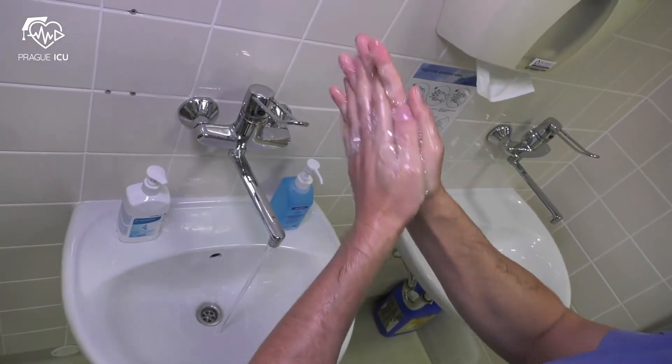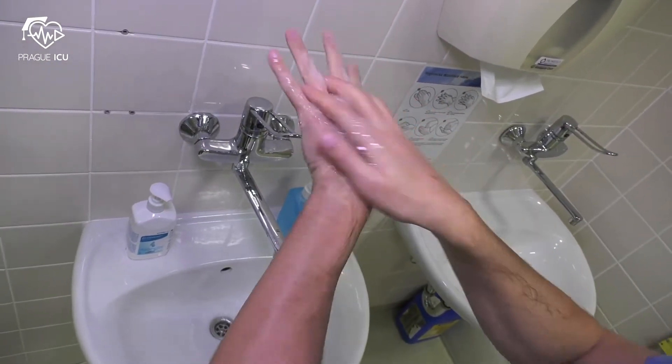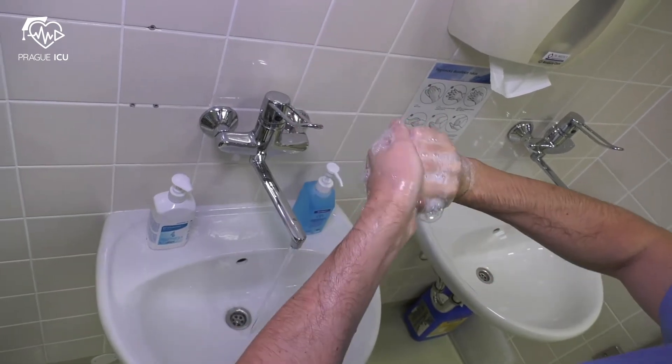Apply soap and spread well on hands. Self-wash for at least 30 seconds.